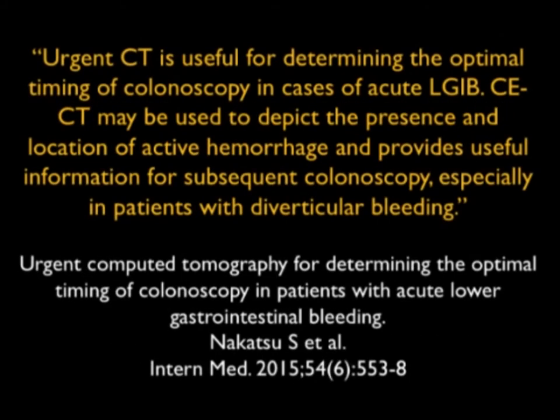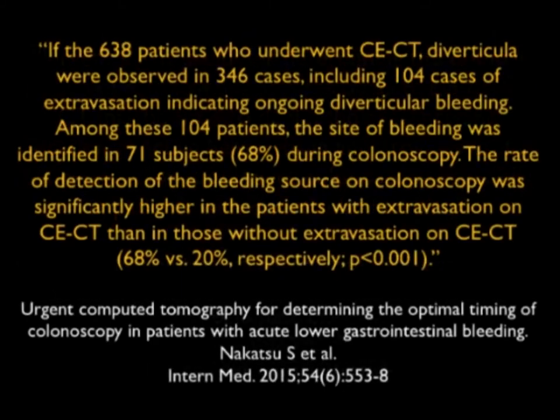Another article was just recently published looking at CT for determining the optimal timing for colonoscopy in patients with GI bleeding. Urgent CT is useful for determining the optimal timing of colonoscopy. CT may be used to depict the presence and location of active hemorrhage and provide useful information for subsequent colonoscopy, especially in patients with diverticular bleeding. So what we do is we provide a roadmap.